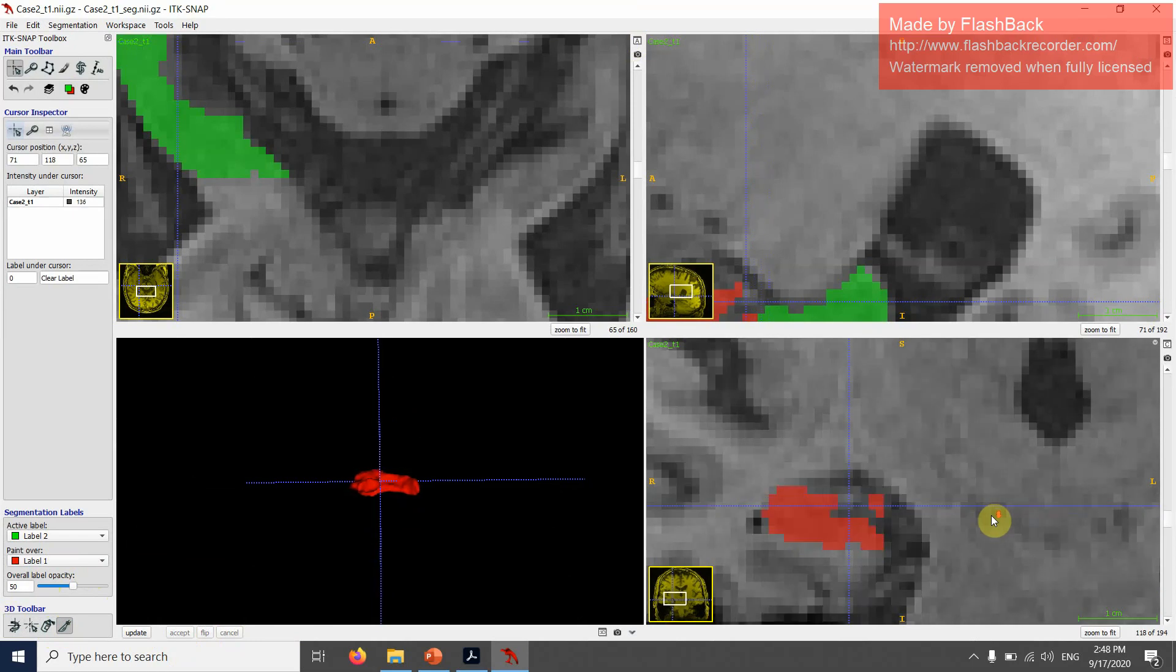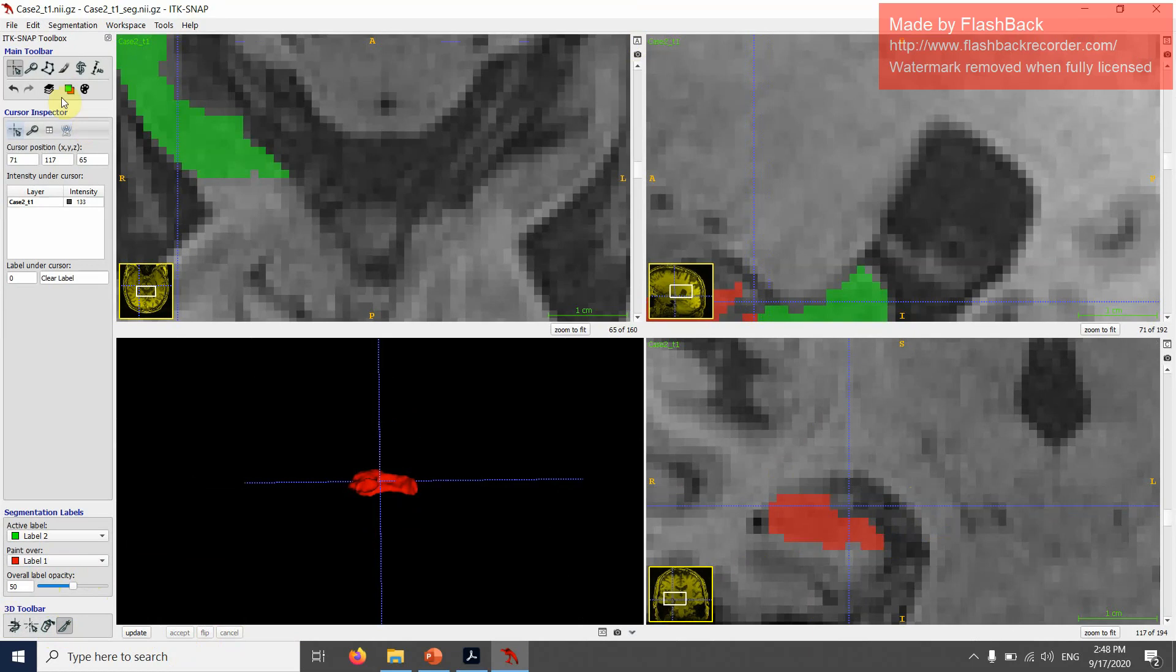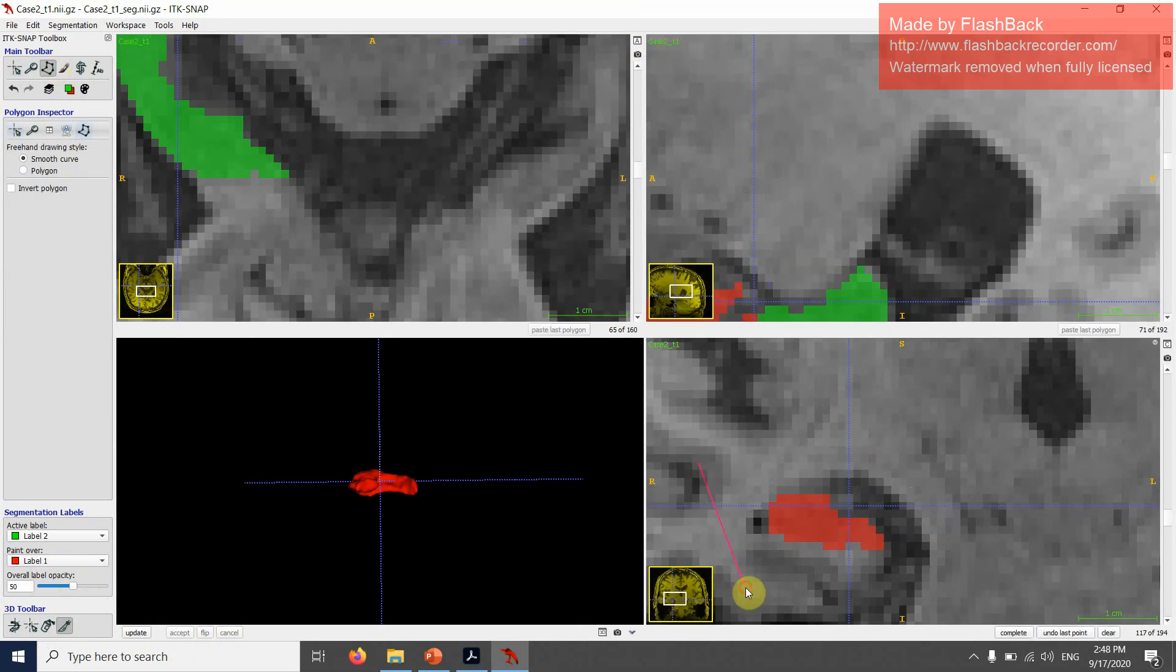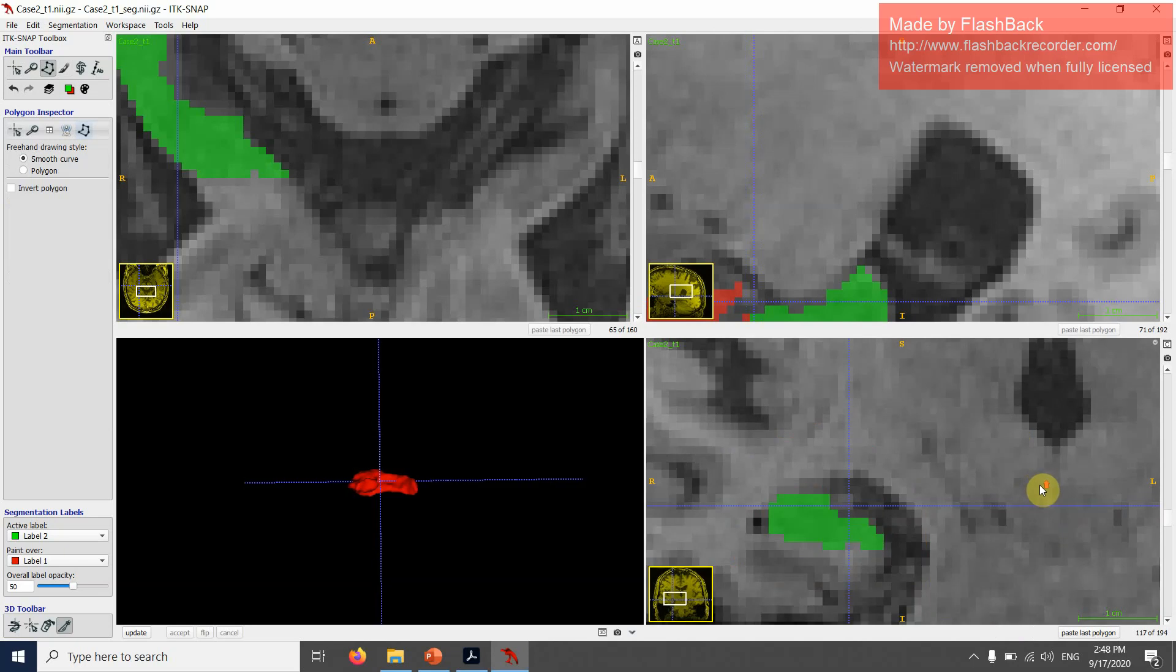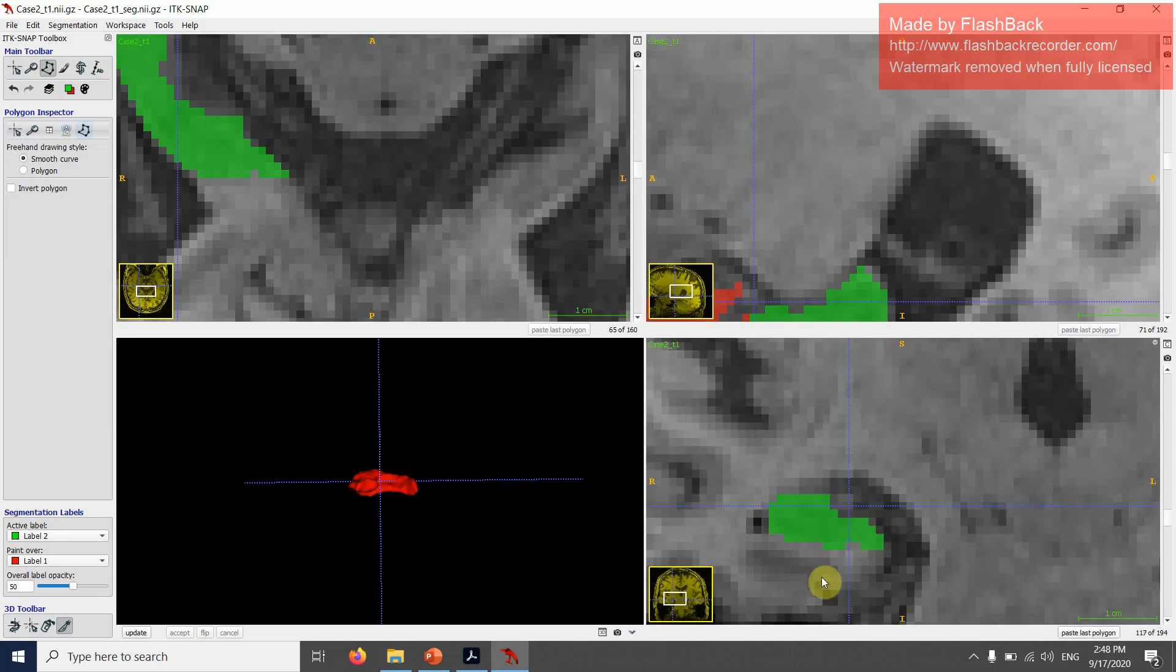Now I see that this one is red, but this one should already be green. So I will just fix that one slice. Now it's correctly divided into anterior and posterior hippocampus.